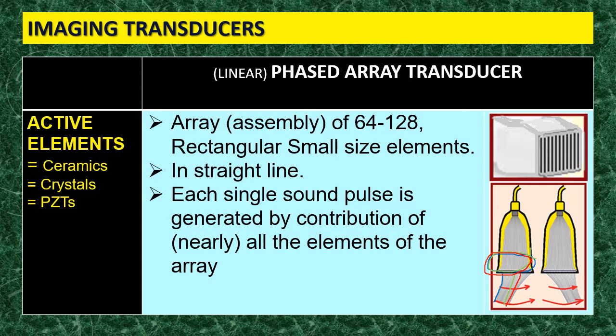All of them. So this is something that we need to know, that all the crystals or the ceramics in this phased array transducer are sharing together, collaborating together to form each pulse. Each pulse, each sound beam is formed by all the elements of the transducer. I like to call it teamwork. All of them are sharing in each pulse.